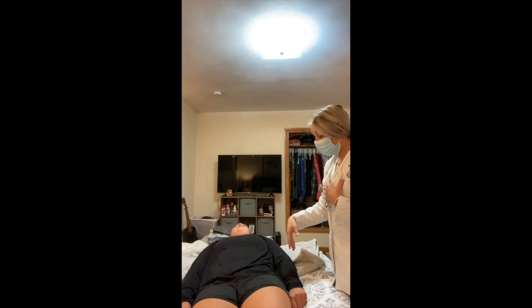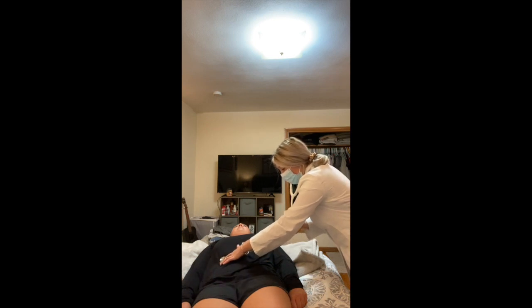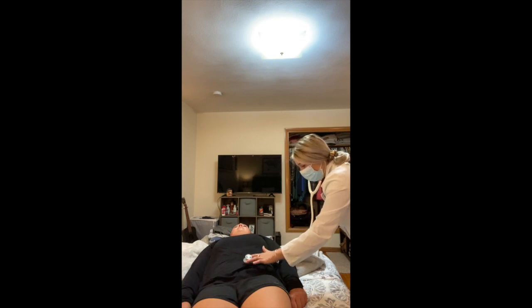So now I am going to auscultate in each quadrant, starting in the lower right-hand side. This is the first quadrant. Listening for bowel sounds. And then moving up to the second quadrant. And the fourth quadrant is the left-hand upper side. And then, well, this is the third. This is the fourth quadrant, the left lower. Okay, great bowel sounds, Riley.